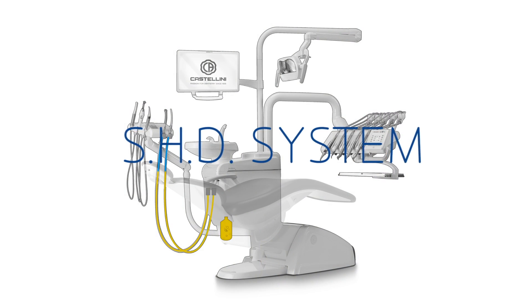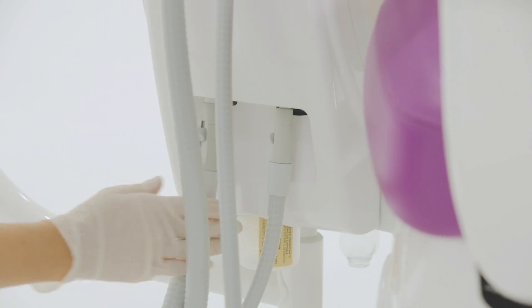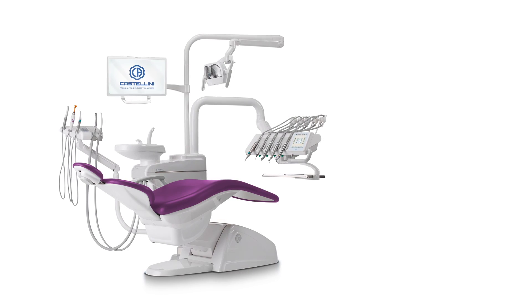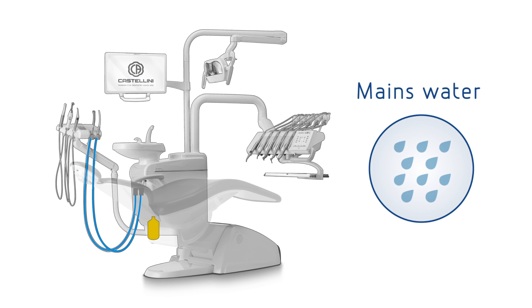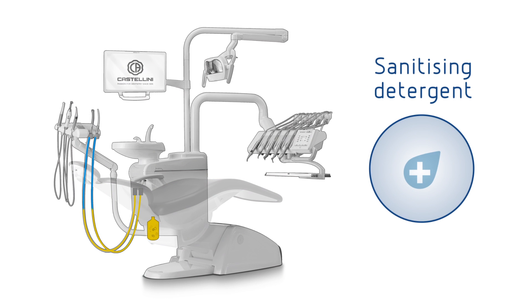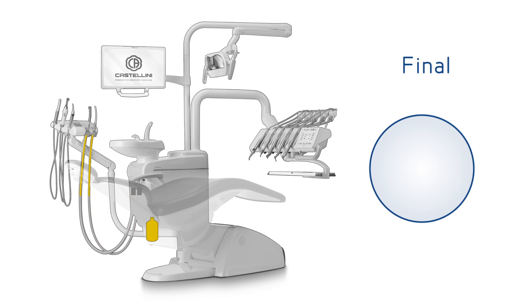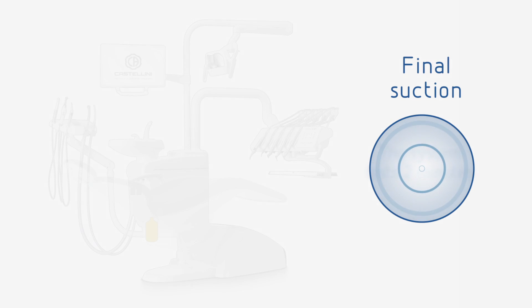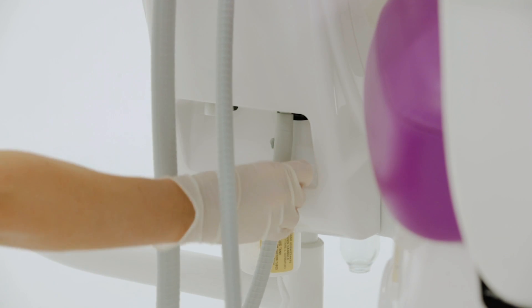The SHD system is automatically activated after the insertion of the second suction hose. The following steps are performed: delivery of mains water, addition of sanitizing detergent, and final suction. At the end of the cycle, the suction flow stops and the message 'put suction tubes back in place' is displayed.